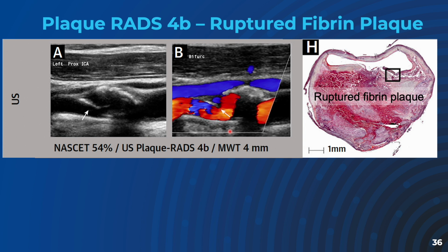And I wonder if we had cine loops of this carotid study, we might actually be able to appreciate movement of the free fibrous flap on the ultrasound.